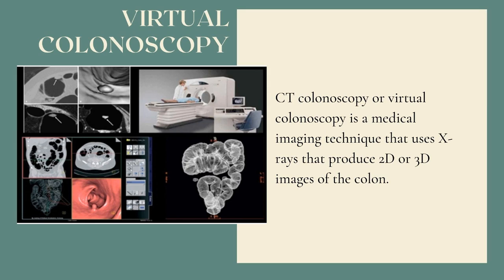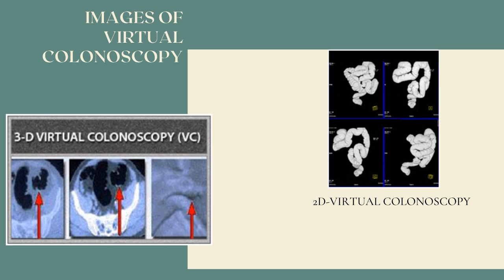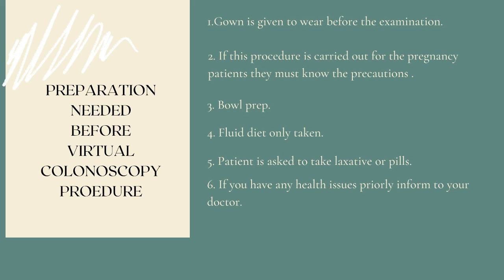If your doctor is concerned about the quality of the view through the scope, he or she may recommend a repeat colonoscopy. If your doctor wasn't able to advance the scope through your entire colon, virtual or CT colonoscopy is recommended to examine the rest of your colon. This is about what is virtual colonoscopy. So these are the images that are taken during virtual colonoscopy. This is a normal virtual or 2D and also a 3D virtual colonoscopy.